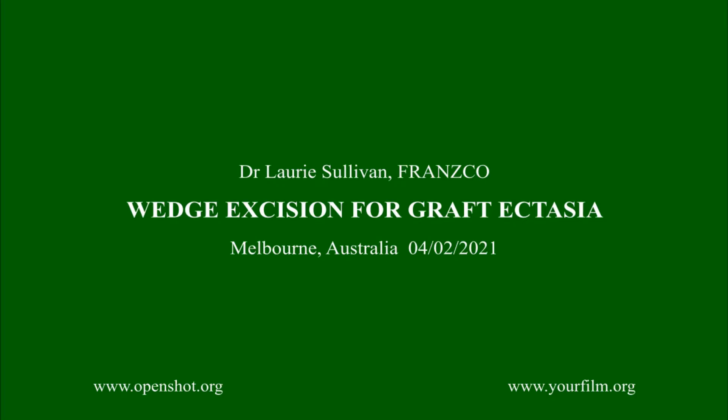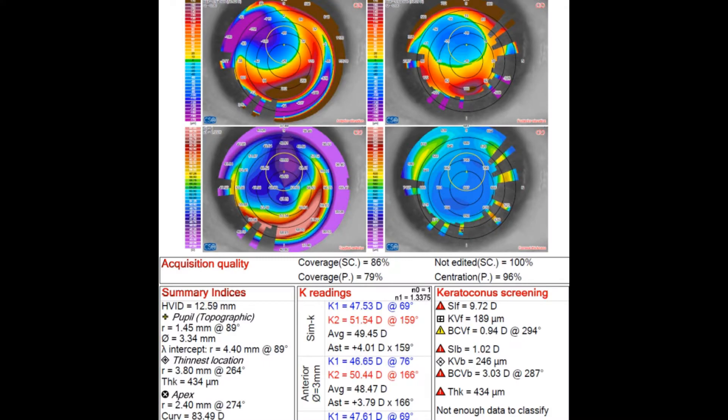Hello, this is Laurie Sullivan from Melbourne, Australia. I'd like to present a refractive keratoplasty.